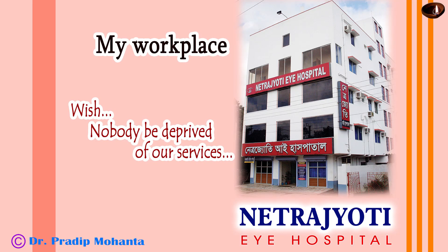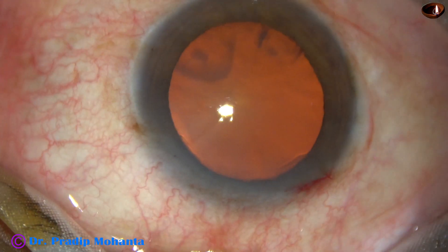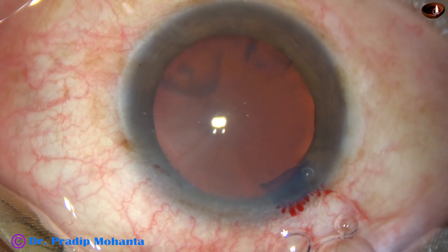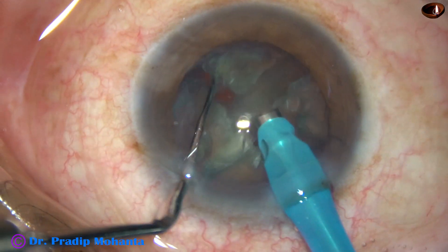Friends, welcome to my workplace at Ranaghat, West Bengal, India. This is a routine phacoemulsification. In this video my aim is to show capsulorhexis, direct chop, coaxial irrigation aspiration, and visco-cleaning from the corneal endothelium.